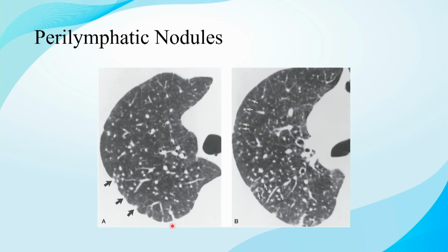And how do we differentiate it from sarcoidosis? As we saw, sarcoidosis predominantly affects the perihilar and bronchovascular interstitium, whereas in silicosis the nodules are more discrete, obviously with a history also, but they are also seen towards the periphery. These nodules may also calcify, and we can also get calcified lymph nodes.